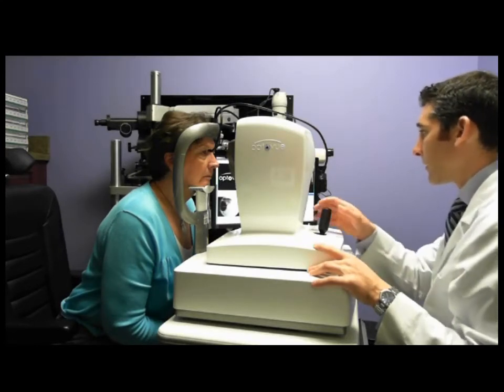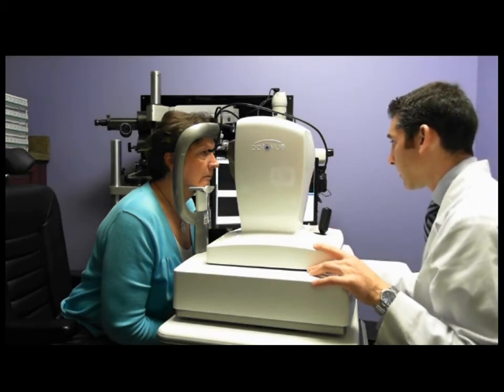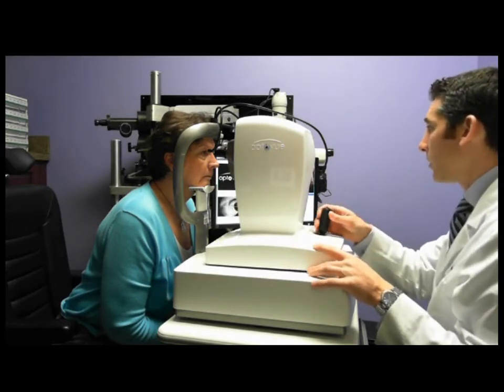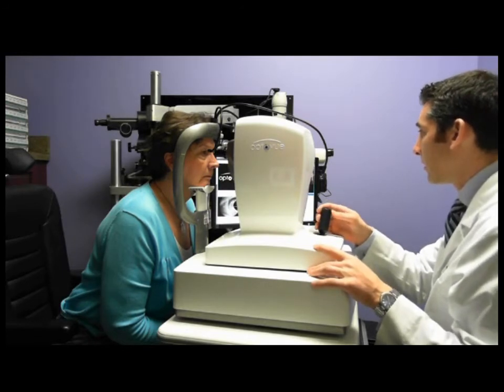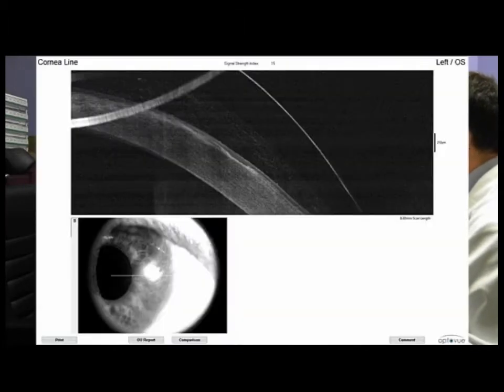That's very interesting about this question of decreasing the visual acuity with excessive vault. There is not one peer-reviewed literature citation which says that excessive vault of either a corneal gas perm or a scleral gas perm results in poor vision, yet we see this anecdotally all the time.